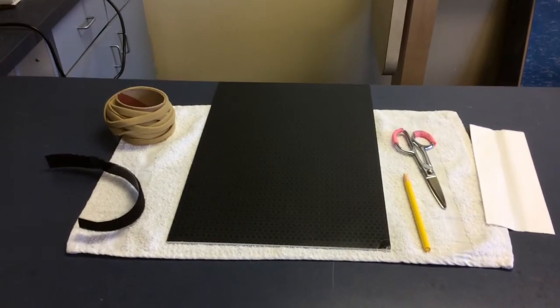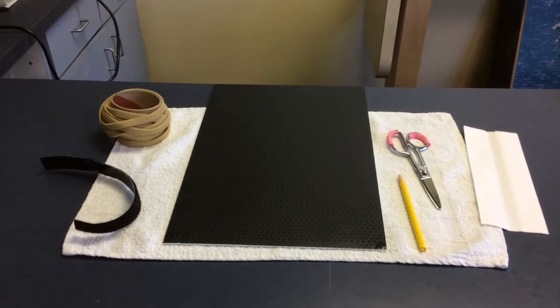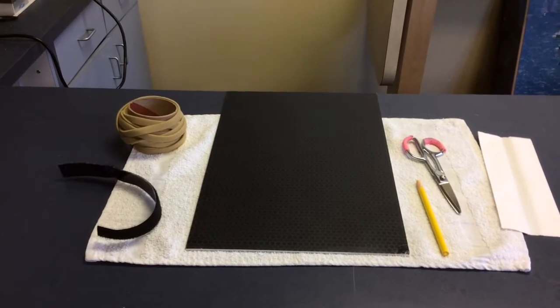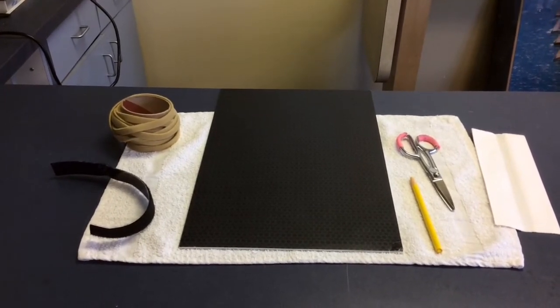This orthosis is called a clam digger. Some common diagnoses that this could be fabricated for are P1 fracture without pins, MCP fracture, Boxer's fracture, and a proximal phalanx shaft fracture.